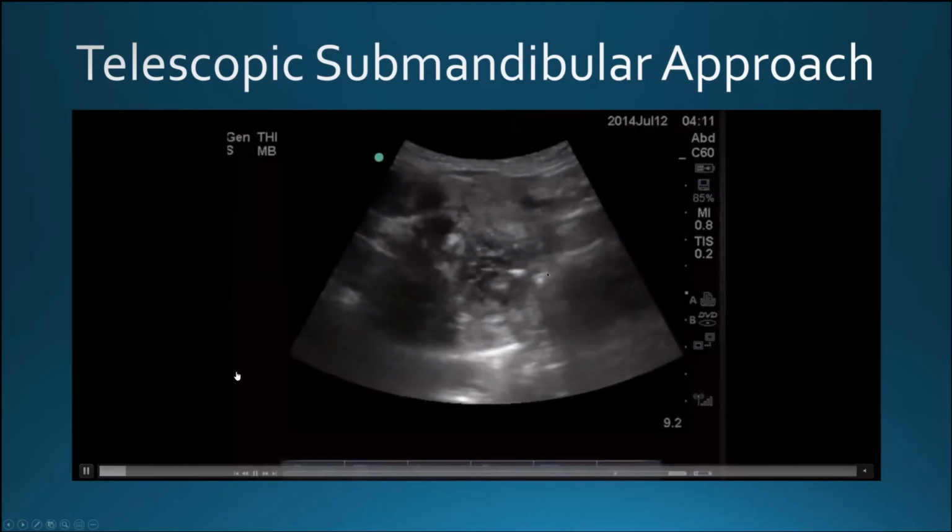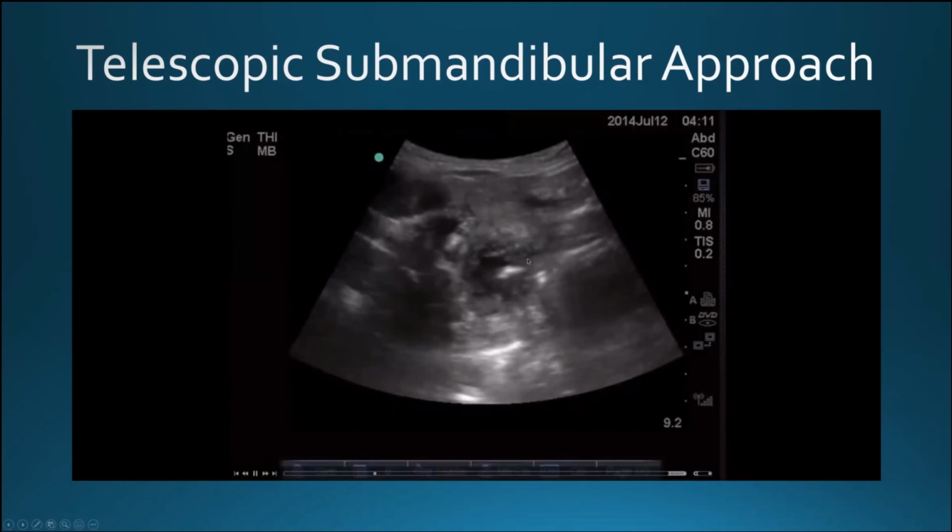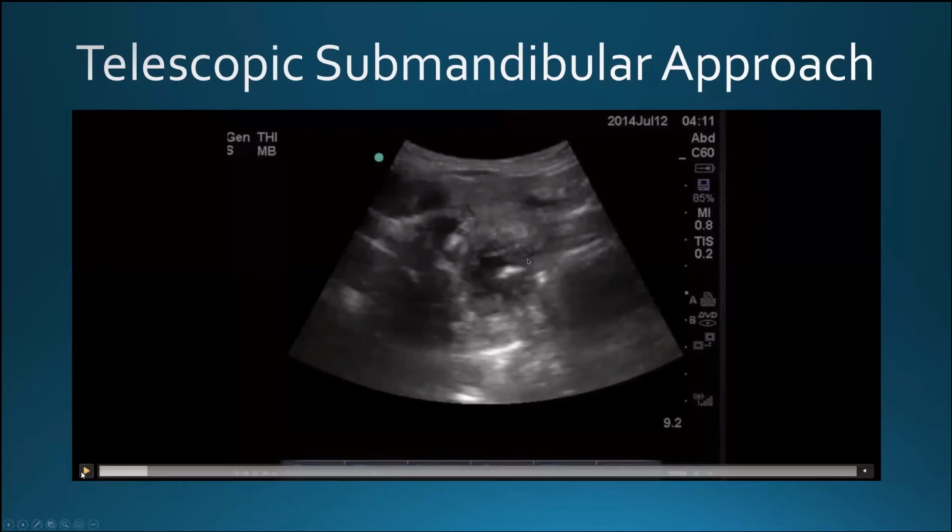And so what you can see here is that right now he's putting some lidocaine into the abscess itself. He probably went a little too far, in that they wanted him to actually put the lidocaine on the outer surface into the actual tissue, then into the abscess. But you can see the abscess swell up a little bit with some of that lidocaine.